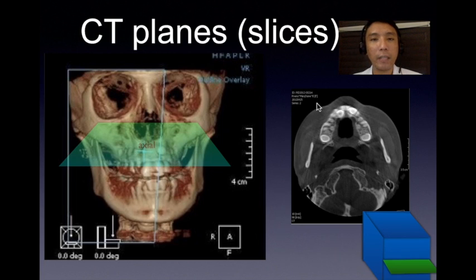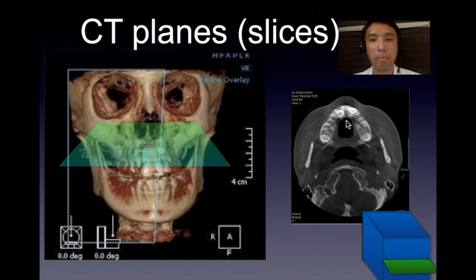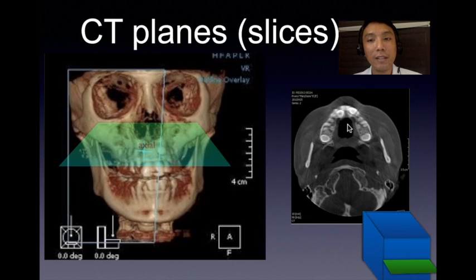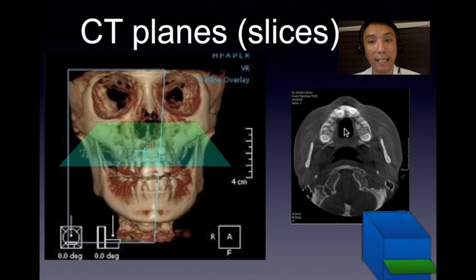Now, one of the interpretation pitfalls is when we see objects like this — is there a hole in the palate of the patient? Remember that since we are only looking at this particular view, when you cut a portion of a rotten part of a fruit, the other part would be on a different slice. Therefore, this does not automatically represent a hole in the palate, but rather, this cut section does not show the roof of your palate.